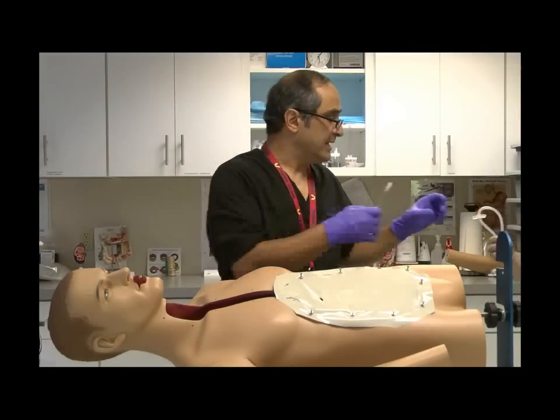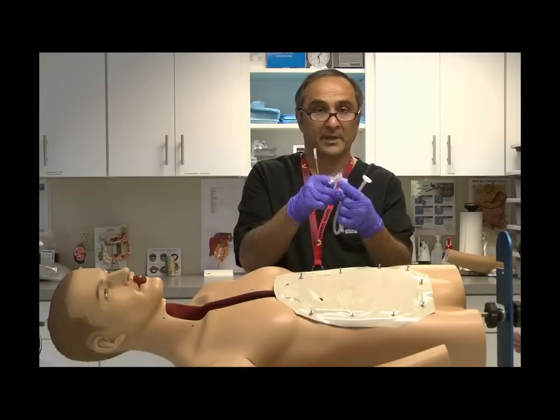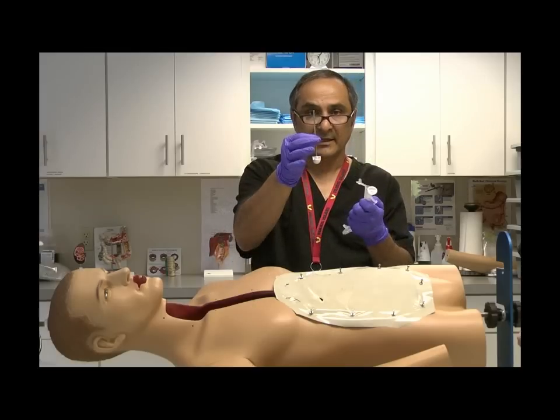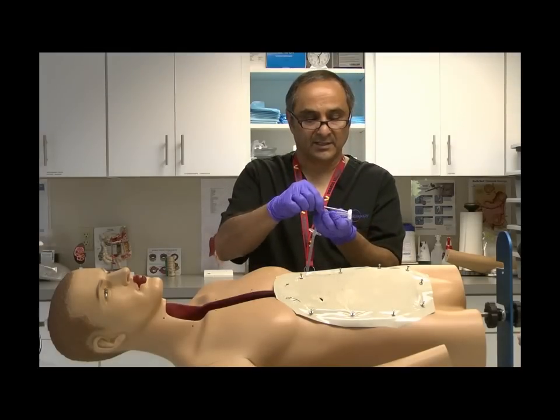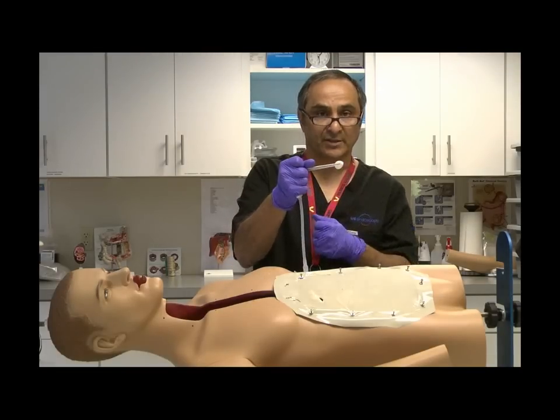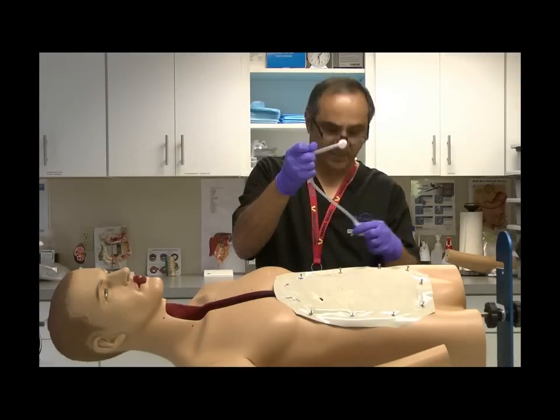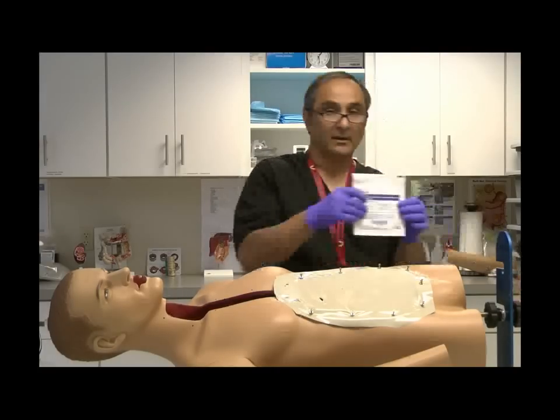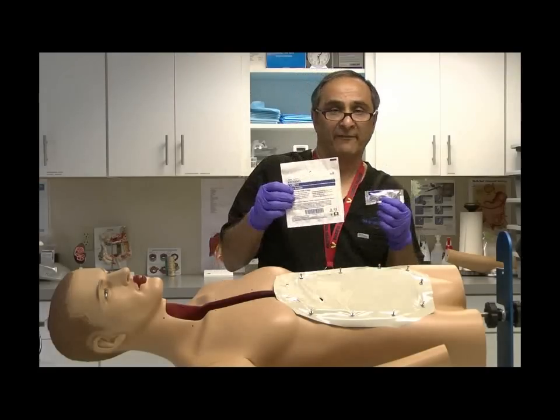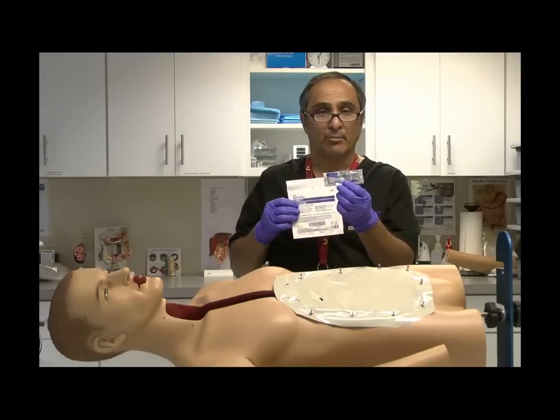The two key components of the non-balloon replacement peg kit include the obturator, which I'm holding here, as well as the non-balloon peg kit or non-balloon peg tube as seen here. The obturator has a silicone protector. Remove that. The obturator tip gets inserted into the dimple hole of the mushroom of the peg, and then it's stretched. I'll demonstrate the technique here in a moment, but included besides these components in the kit we have the following: large 4x4, some KY jelly, the 4x4 to cover the site or clean the site, and the KY jelly to lubricate the non-balloon device prior to insertion.